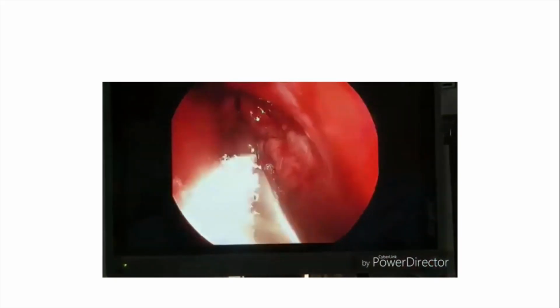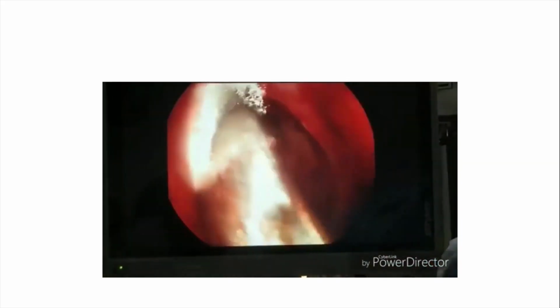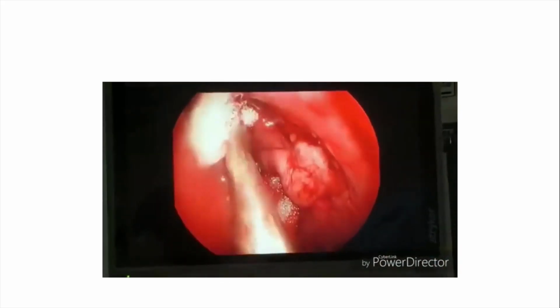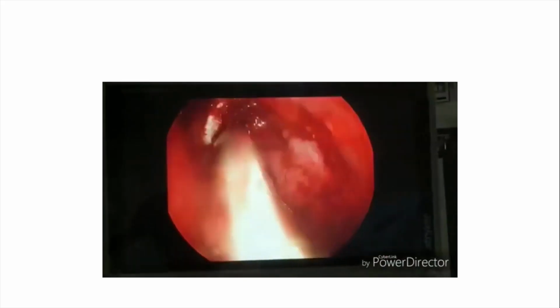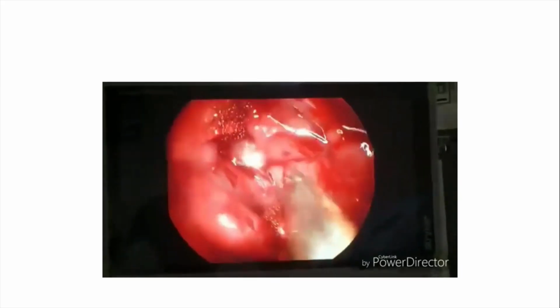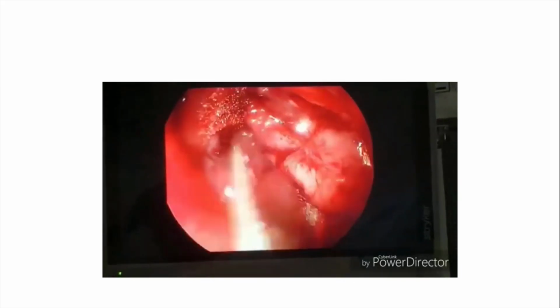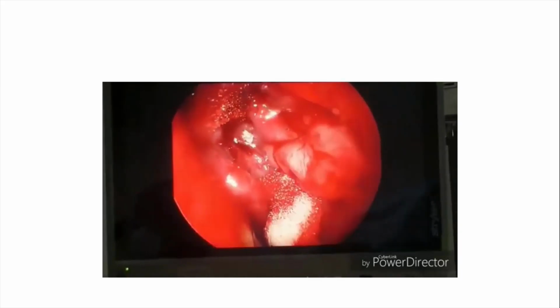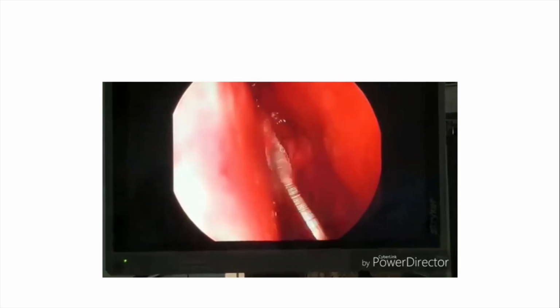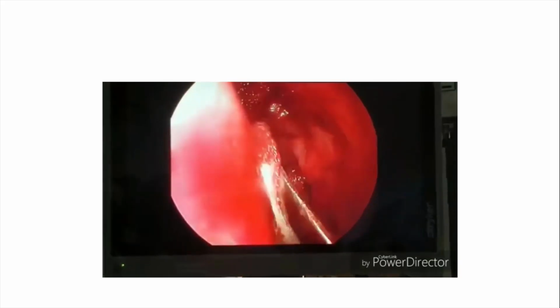Now we will keep the suture over the flaps. It needs good follow-up and proper syringing, and you can give a merocel pack. That's for post-operative. It's a daycare procedure. No big deal. After a week you can follow up; the merocel can be kept even 5 days without any infection. With the help of the suture, flaps remain in position. After the procedure, you can keep the nasal pad with the merocel. In the last, we will pack the nose with merocel to prevent post-operative bleeding from the nose.